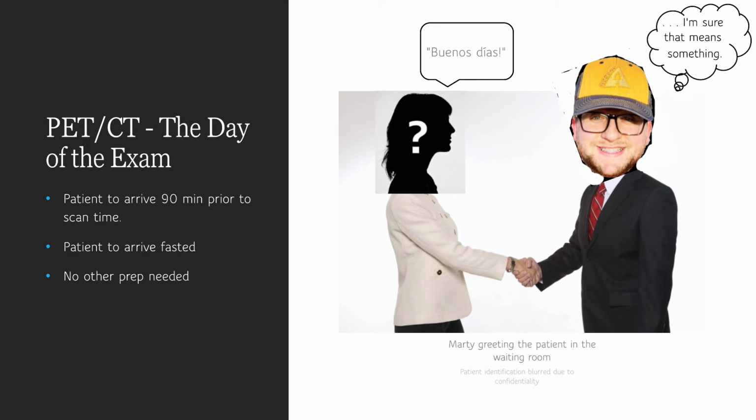PET-CT the day of exam. The day of exam, which was around early September, the patient was scheduled to be imaged at 8 a.m. At my site, we request that all PET patients arrive 90 minutes before their imaging time. The patient was called the day before and was told to arrive fasted. Besides being fasted for a minimum of 6 hours, no other patient preparation was needed for this study.